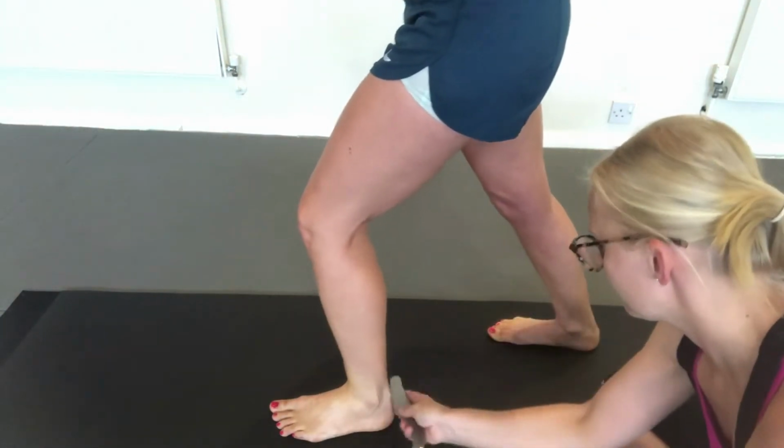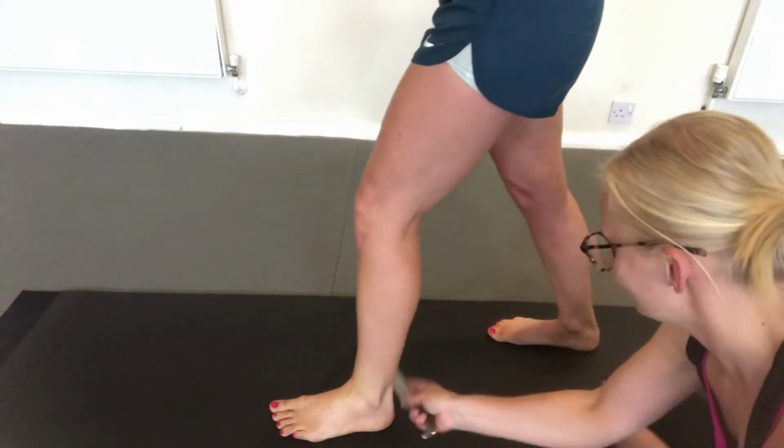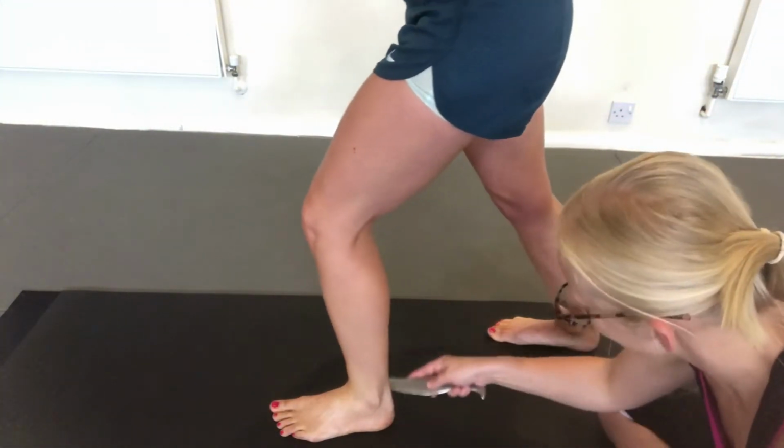You can also work into the posterior ankle, same thing, so foot into plantar and dorsiflexion as you're using the tool around the back of the ankle.